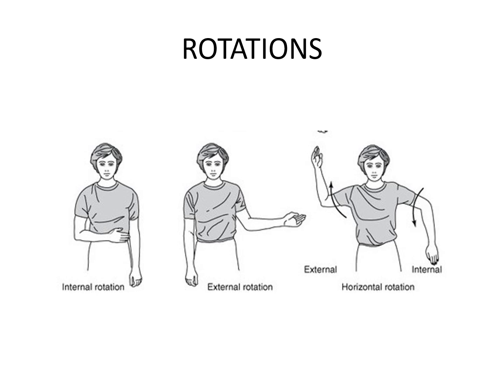Now coming to rotations, you know that there are two rotations available at shoulder joint, which is internal rotation and external rotation. So when you are seeing this first image, the shoulder is at 0 degrees. The shoulder is in neutral position, that means 0 degrees. And when you take the arm towards your stomach, towards your tummy, the first figure A, that is internal rotation at 0 degree shoulder.